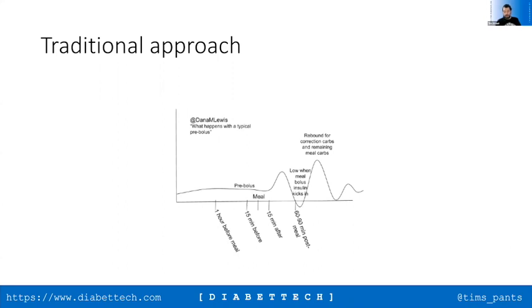If you're using one of the newer faster acting insulins, you're probably not pre-bolusing, because for many people that's not a requirement, as those who mentioned that they're doing no meal announcement, no bolus strategies with Android APS at the moment. And this is why mealtimes, even with a loop, are not the easiest thing to do. And the key thing to remember is a loop isn't magic, because insulin historically, less so with Lyumjev, is slow. So you're trying to match insulin use with the food that you're dealing with, bearing in mind that historic insulins tend to peak at 75 minutes rather than the 15 to 20 that everybody was told when they were given them 20 years ago.